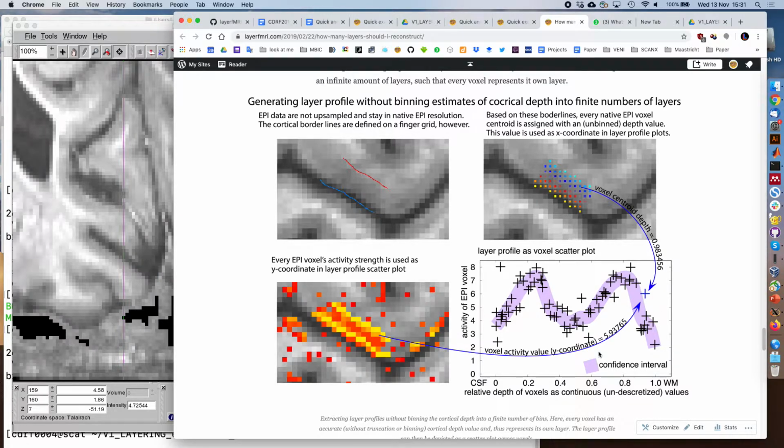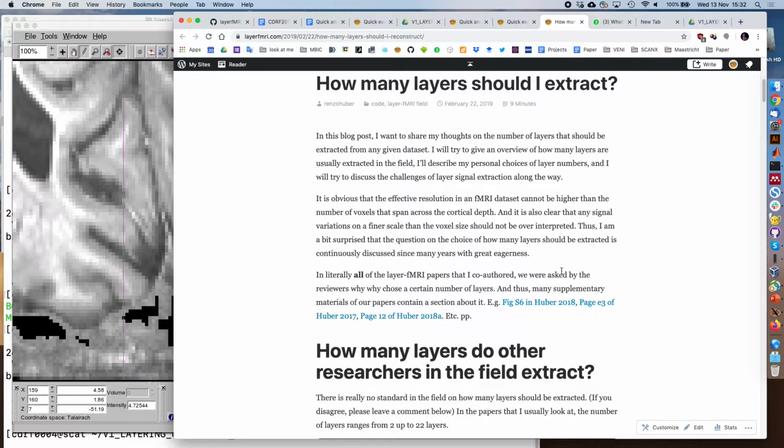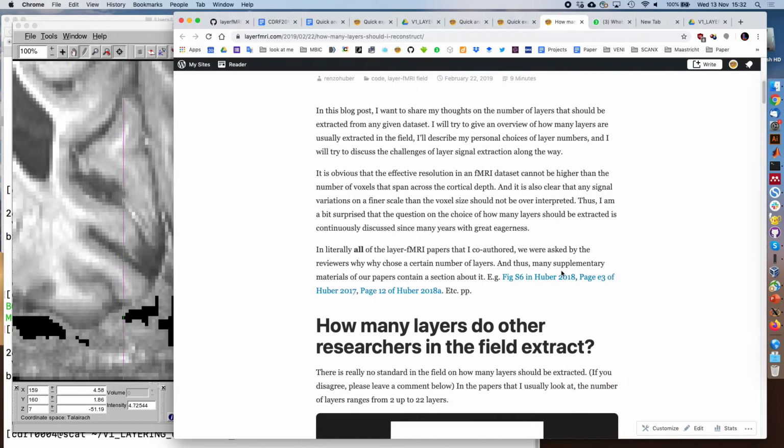Obviously, then you don't have a continuous measure. But usually in many other statistical tests, you don't have that either, right? In fMRI time series, you sometimes censor individual time frames where you have a lot of motion, throw it out. So there are statistical ways to deal with that, to have a non-continuous fashion and plot it like Ravi Menon did in a kind of point plot like that. And then Tim has ideas on how to solve that. It might not be a problem for layer-dependent fMRI.